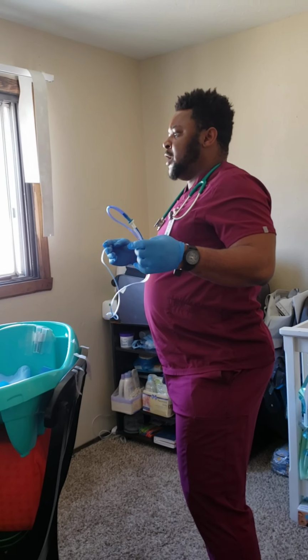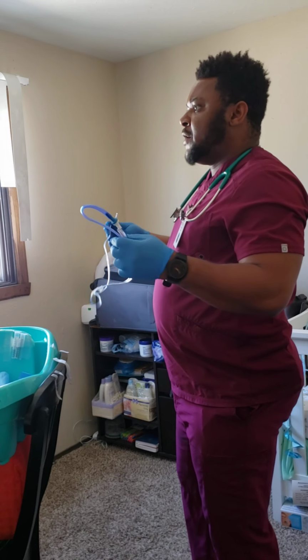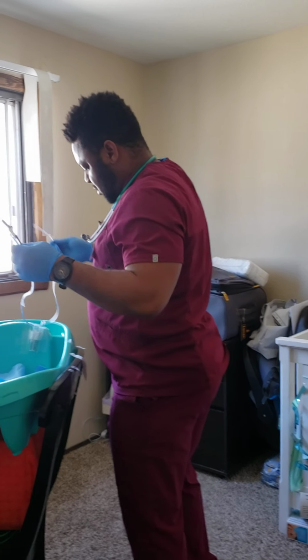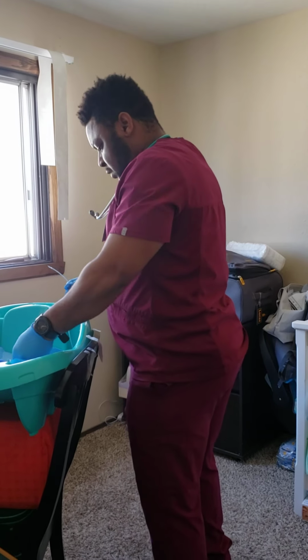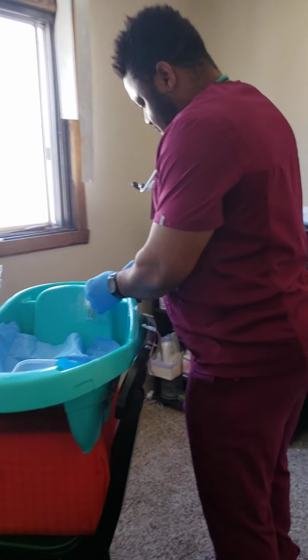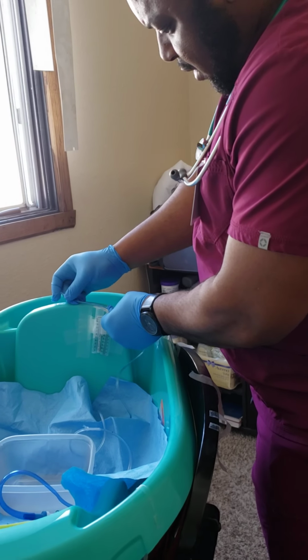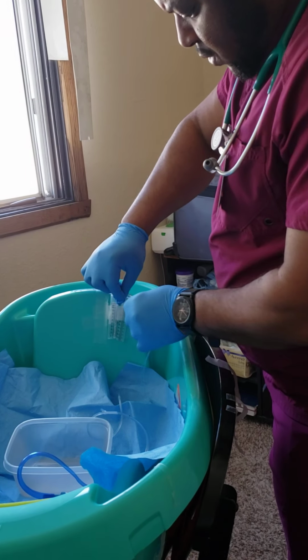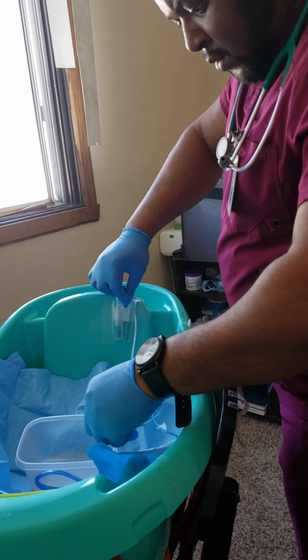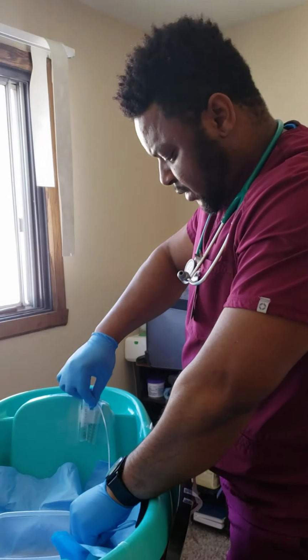I'll measure from the earlobe of my patient to the nose and down to the xiphoid process. So from the earlobe right to the nostril, and I'll hold it right there and down to the xiphoid process.